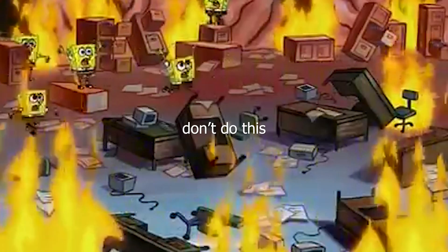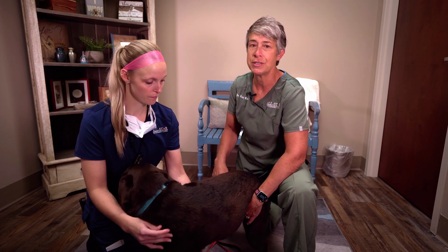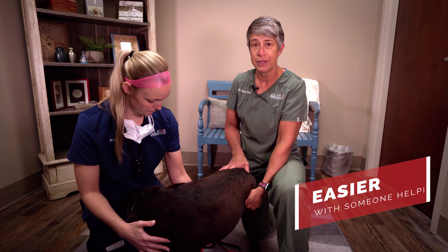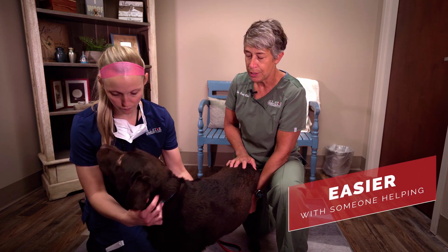You've been asked by your veterinarian to give subcutaneous fluids, or maybe you've been asked to give a subcutaneous injection because your pet's been diagnosed with diabetes and now you have to give insulin. Don't panic. The easiest way to give a subcutaneous injection, whether you're giving fluids or medication, is to have someone else holding the pet for you.